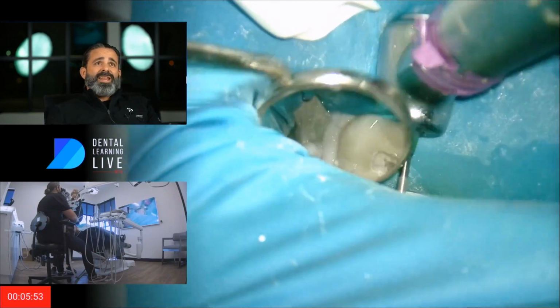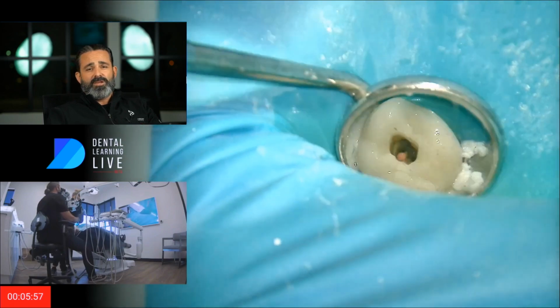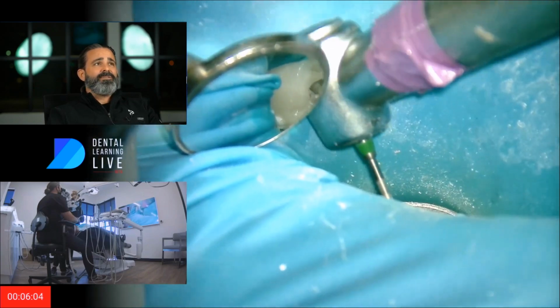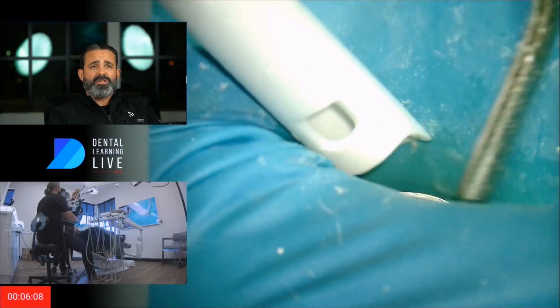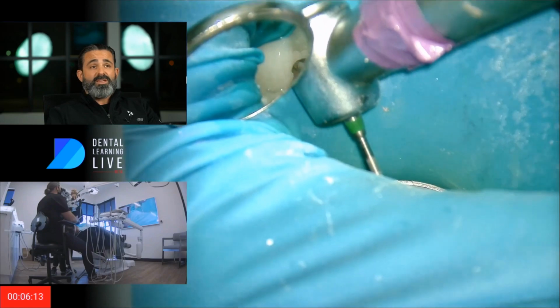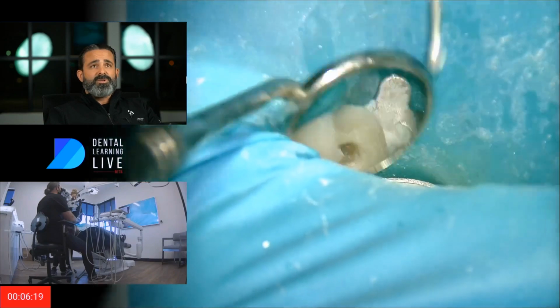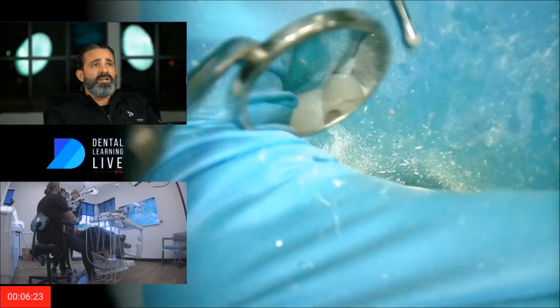So we're going to access, and I'm going to pay attention through this access to whether there is something going on inside that crown. Meaning, do I have good margins? Is the foundation solid? Do I have recurrent decay? If I do, that might be an influencer both to etiology as well as the ability to even perform the GentleWave in some cases if the crown is leaking, or maybe I should cut off the crown. But in this case, so far so good. Things look really adequate inside there, so I like that. Smooth sailing.